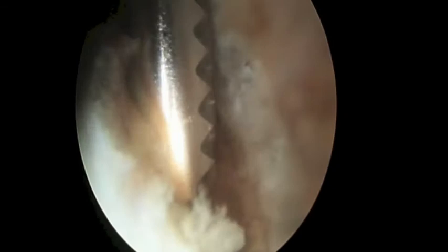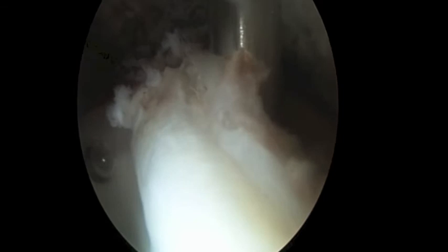Here you can see the loose cartilage. We are debriding the undersurface of the labrum tear in these images with a shaver. You can see the labrum to the left on the image. She also had cartilage damage, and we are removing some of the loose cartilage in her hip with a shaver.